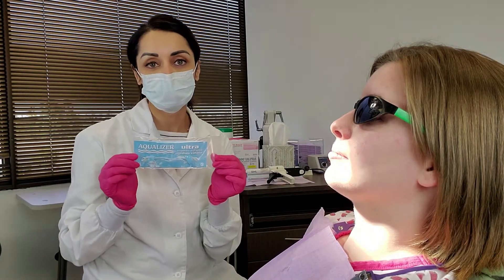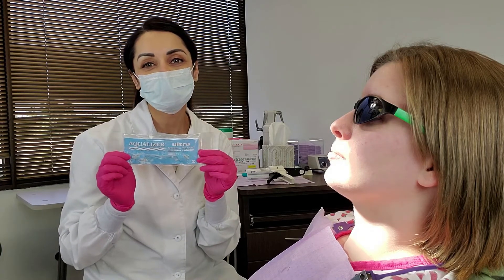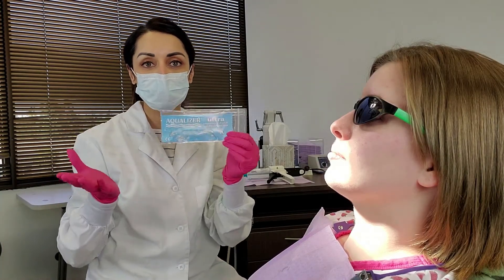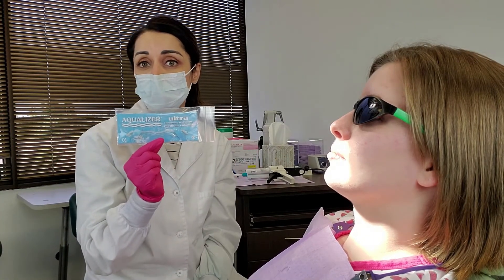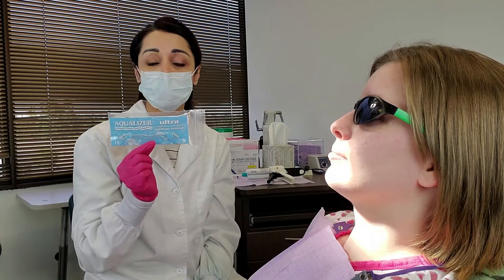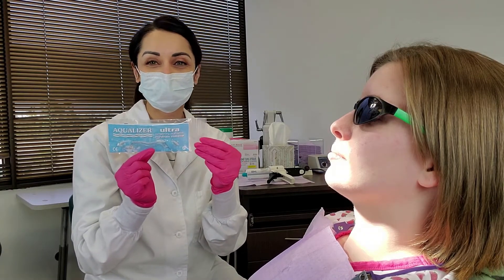The reason I do a lower night guard with an Aqualizer Bite is because the Aqualizer has two little pads filled with sterile water. These pads serve as a waterbed for the muscles in the head, neck, and jaw. When this Aqualizer is worn for about 20 minutes, the muscles actually float to their happy place, and then we record that happy place by taking a bite. We then send that bite and the models of the teeth to the lab and ask them to build a lower custom night guard.